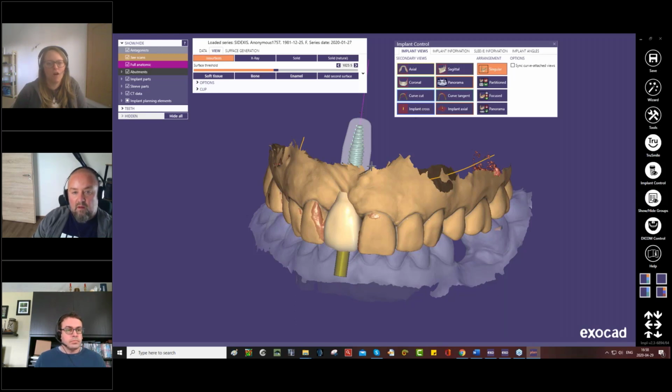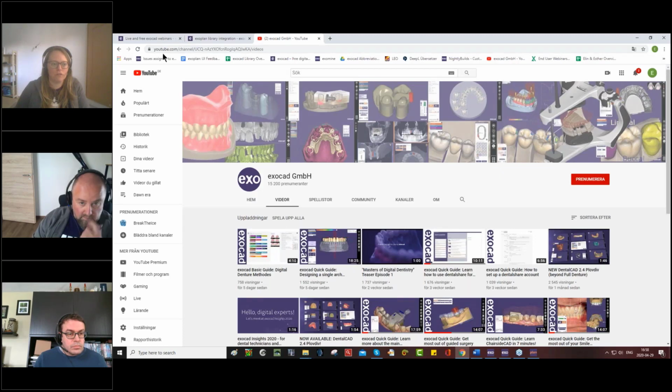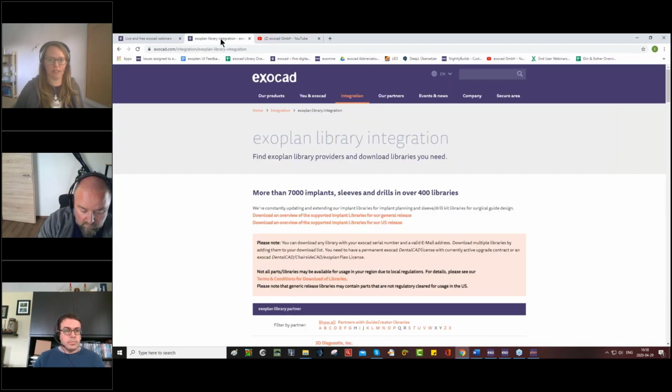All these things are the same in the implant module for CAD, and I think we have a detailed video about that on our YouTube channel. That could be the case, Michael, that we have a video for the implant module, how to use that. So on youtube.com, we have a lot of exocad videos, and you can check it out there and find out more.